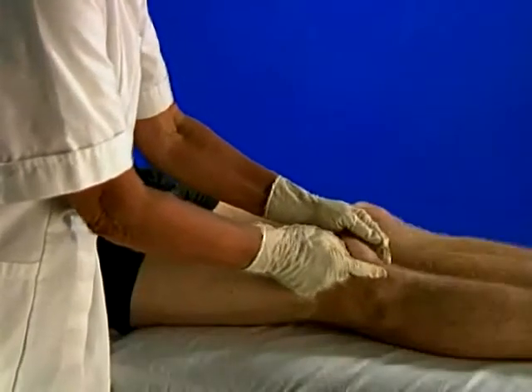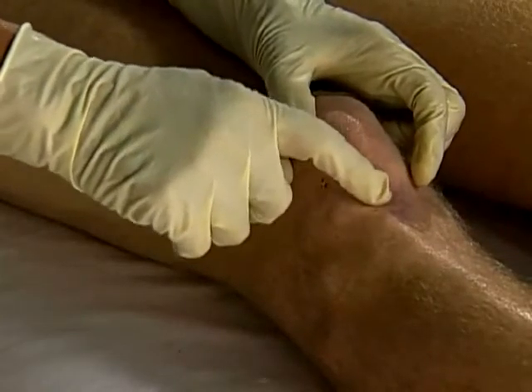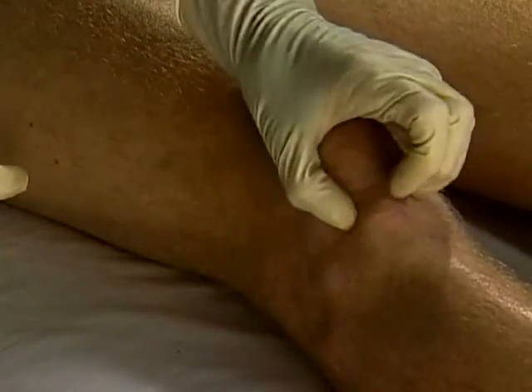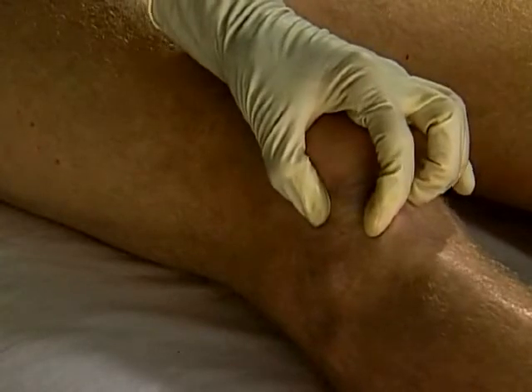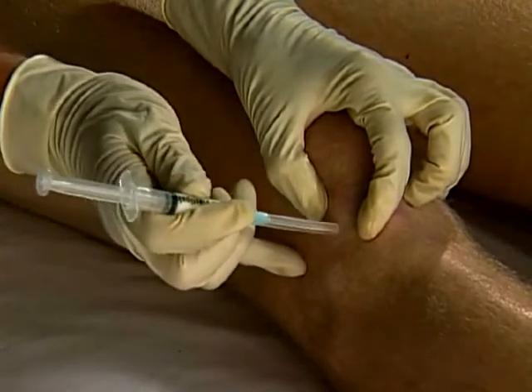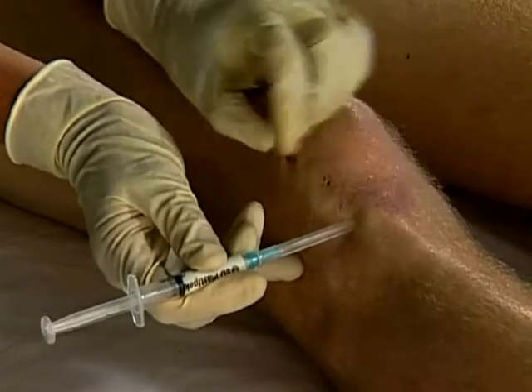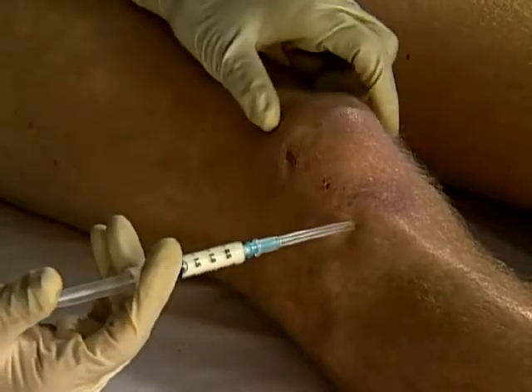The bursa lies immediately deep to the infrapatellar tendon. The tender area is usually at midpoint of the tendon, which is approximately 2 fingers wide. Mark the entry point at the edge of the tendon, clean and firmly stretch the skin, and rapidly insert the needle perpendicularly. Pass behind the tendon to approximately midpoint, taking care not to enter into it. Aspirate and inject as a bolus.